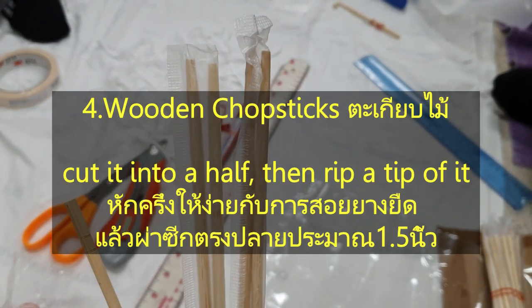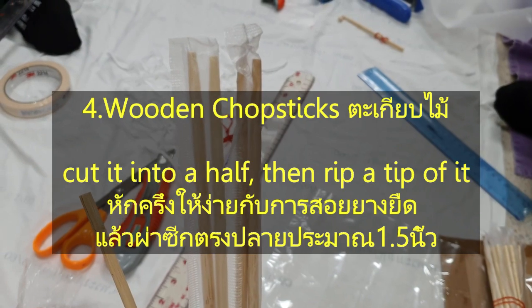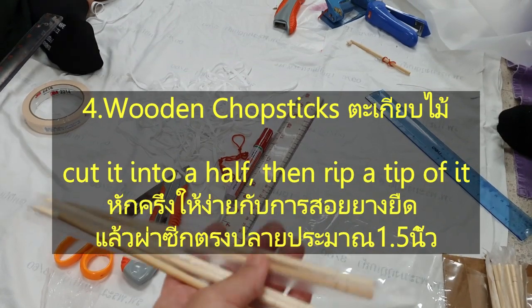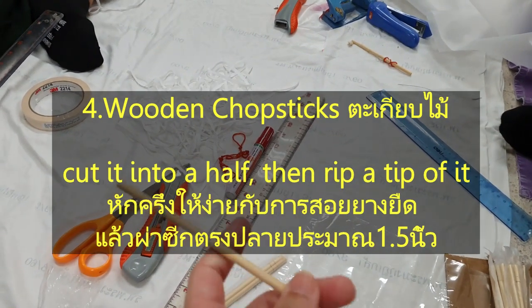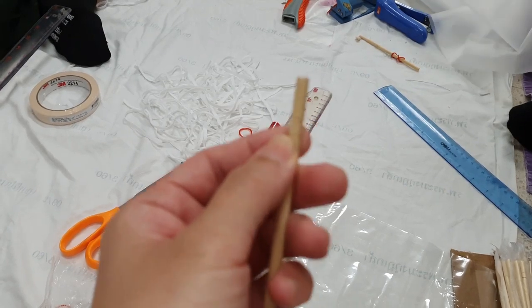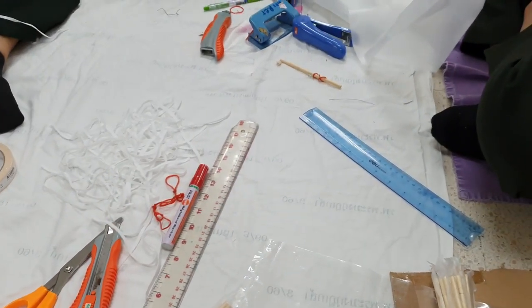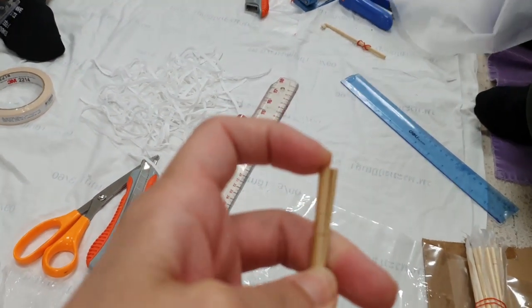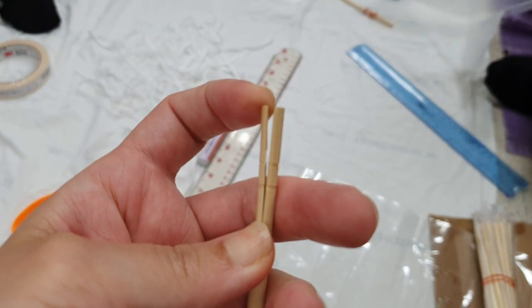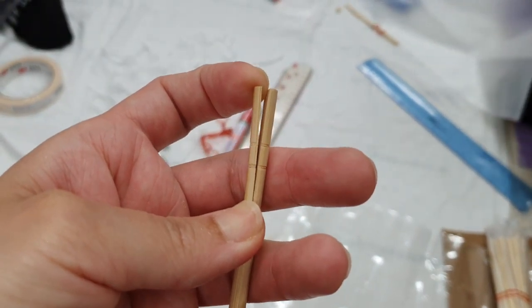Another instrument that we will use to put the elastic braided into the shoe leg cover is chopsticks — the kind you have in a Chinese restaurant. You will make a mark at the end of the chopstick so you can put the elastic braided inside of it and thread it into the edge of the leg cover.